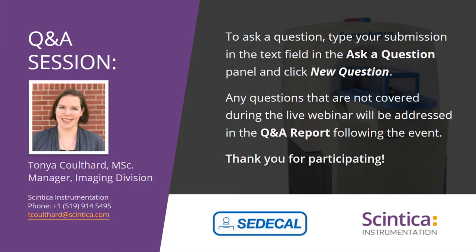So there will need to be a place where the tracers themselves can be handled, as well as the animals. Once they're injected, they will be radioactive for some time, depending on the tracers that are injected. So a space will be required to prepare, calibrate, and inject the radio tracers. As well, you'll need monitoring equipment to make sure that that area is clean and that all the radioactivity is cleaned up once the imaging session is complete. And then you may want to take into account a place for the animals to be held while the radioisotopes continue to decay after the imaging session is complete. But again, all of this is considerations across all PET systems and not the system specifically.